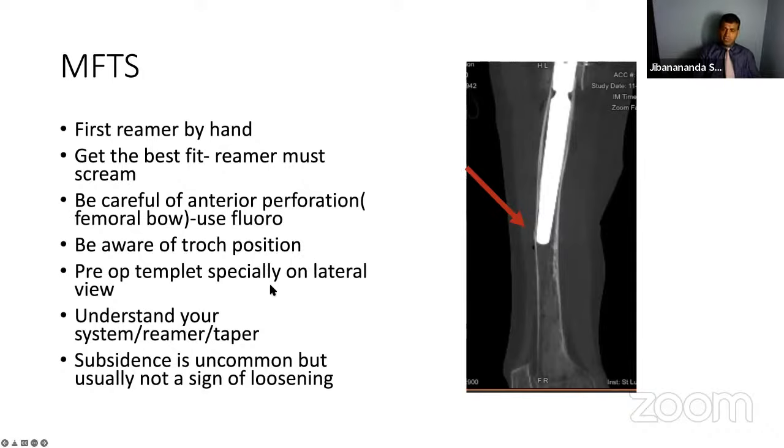Pre-op templating, especially on the lateral view, is important. Understand your system. Reamer taper is of paramount importance; you must know your reamer taper and what works. Subsidence is uncommon, but is described in about 11% of cases in some series.